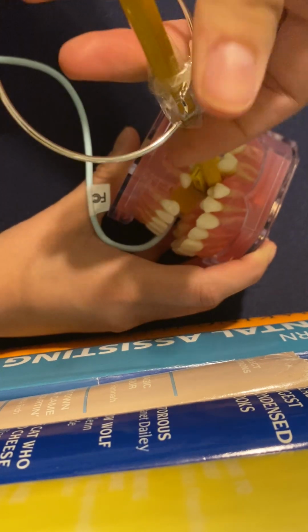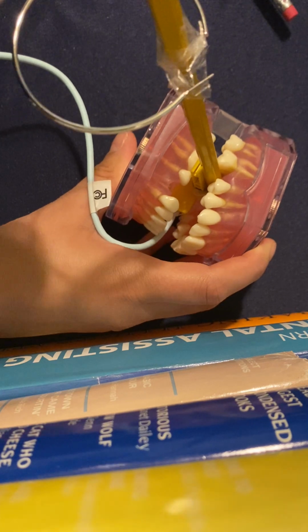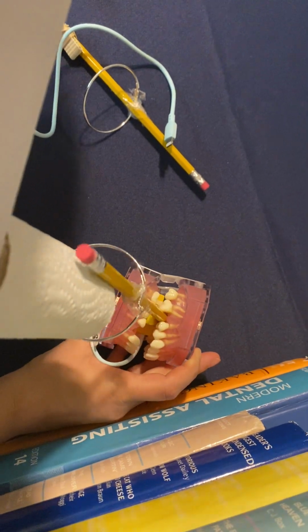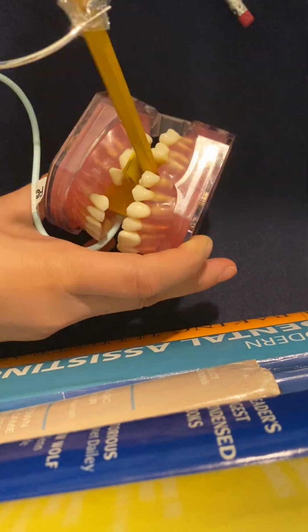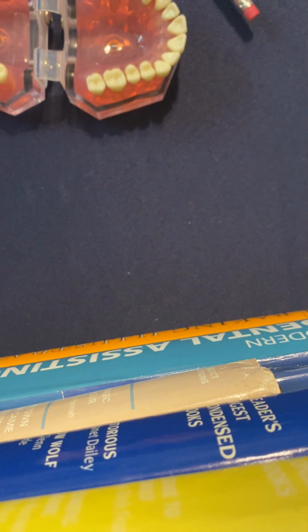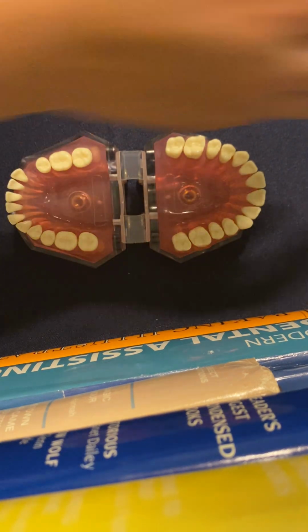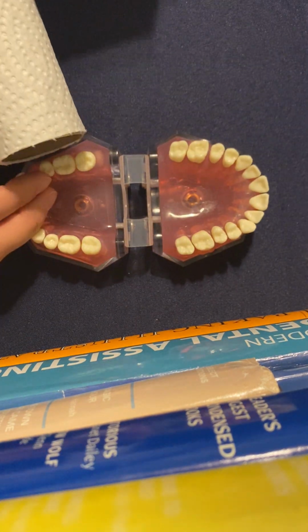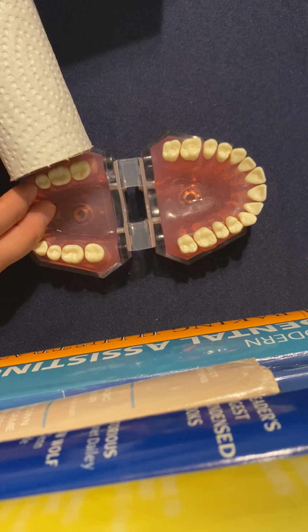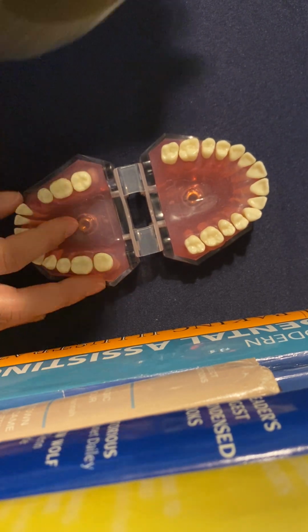Sorry, the tape's coming undone a little bit. Oh, there we go. Stay sweet. You're going to want to line it up like this. Point down from the outer canthus to the mid-mandibular. Like I said, to avoid that cone cut, you're going to want to really try to get this close, but parallel with that sensor.